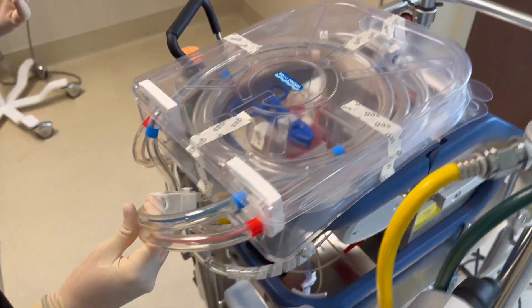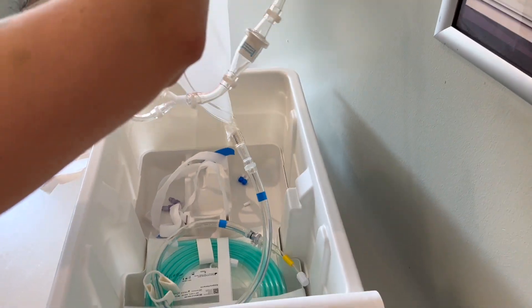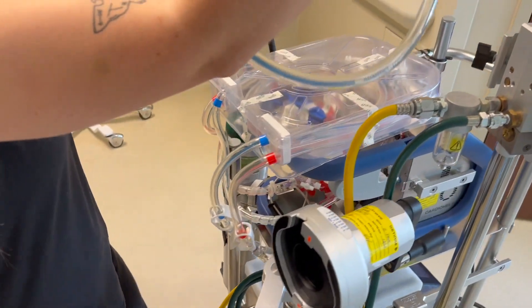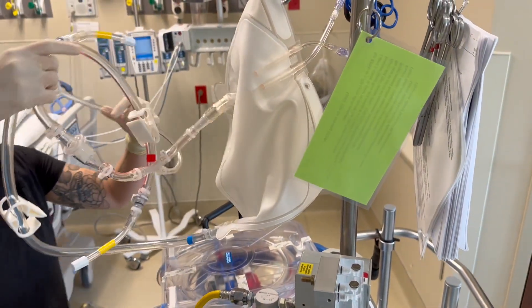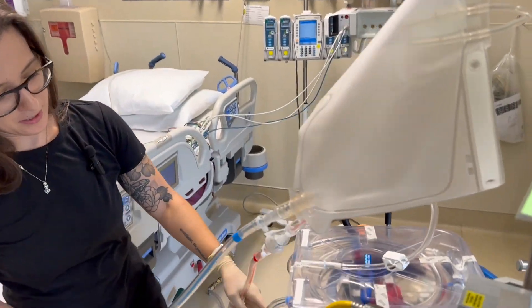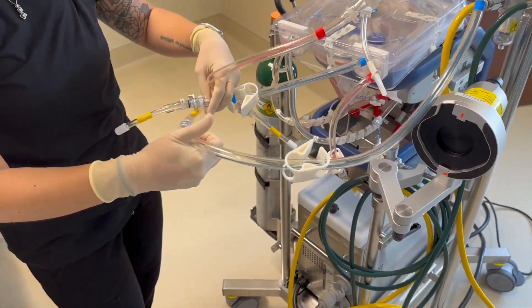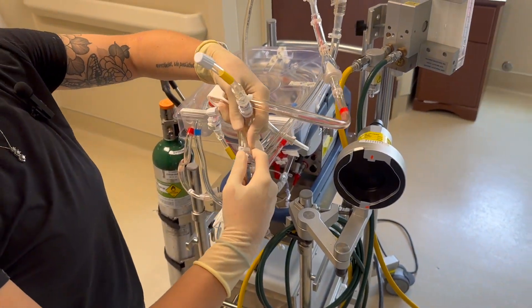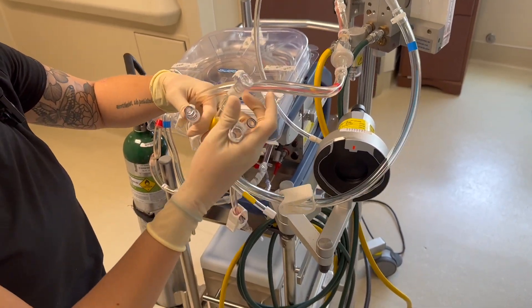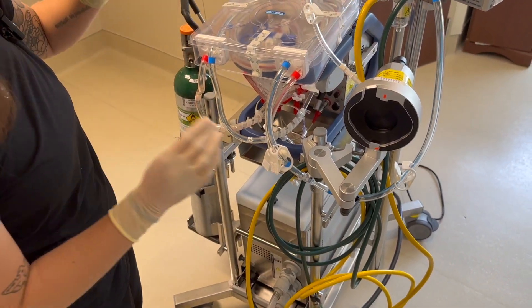Now you'll attach the prime bag. Place your prime bag on your pole. You're going to attach blue to blue and red to red — there are quick connects here. You're going to take your quick connect off by pushing the button and pulling. Then attach your blue here, and your red goes to your red.